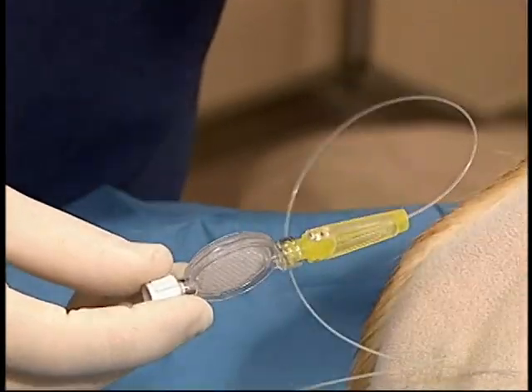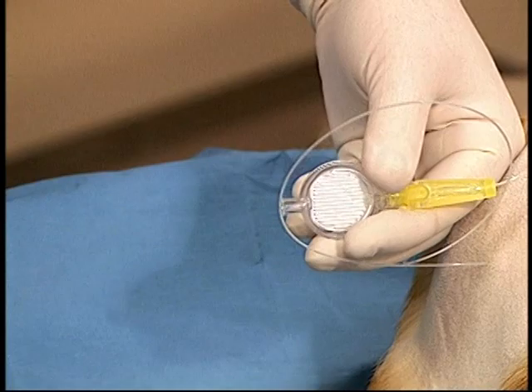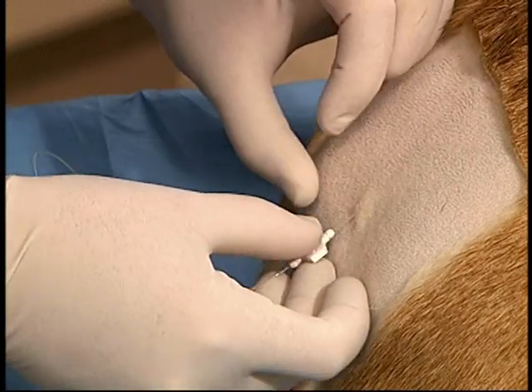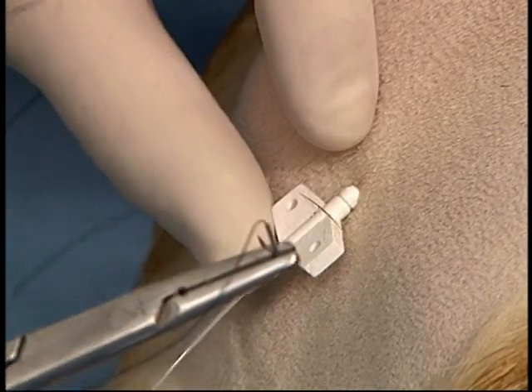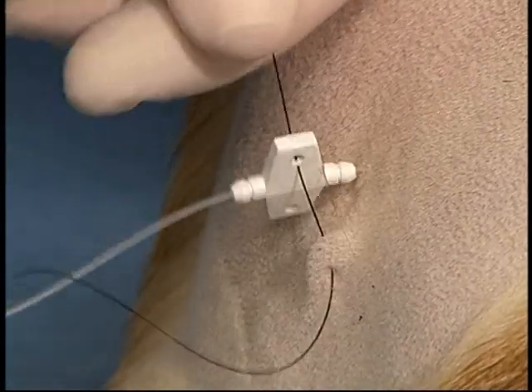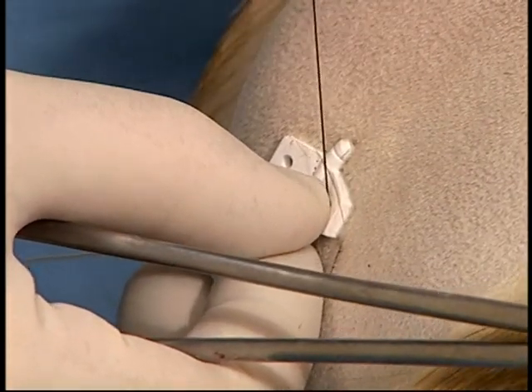A filter is attached to the luer, and at this point in time, injections can be given. The butterfly wing is placed over top of the catheter at the skin entry site and sutured to the skin. The suture grooves in the butterfly wing also must be sutured to prevent the catheter from sliding off the butterfly.